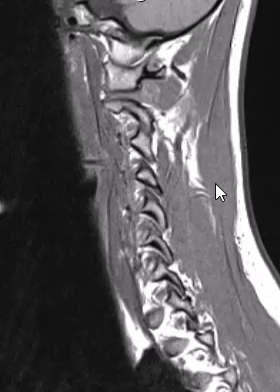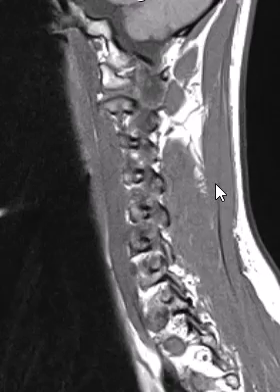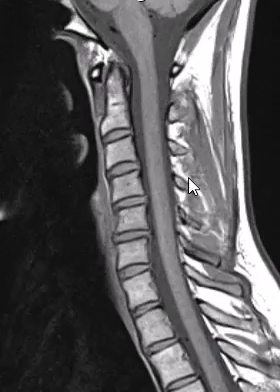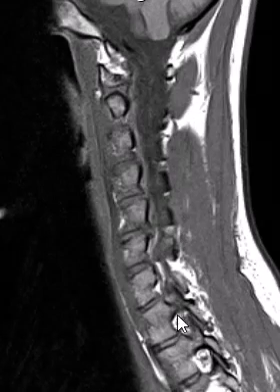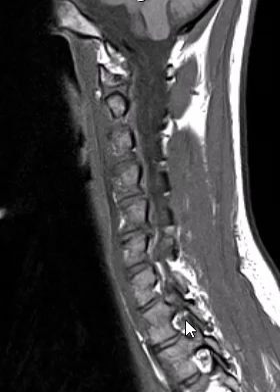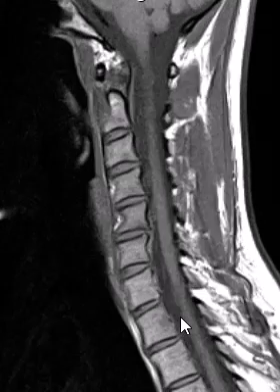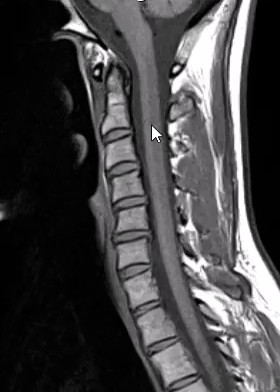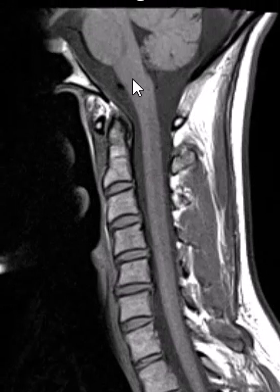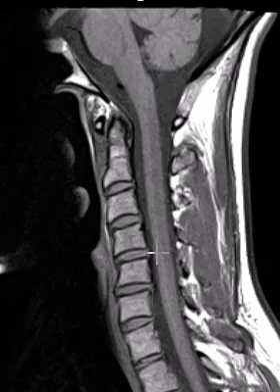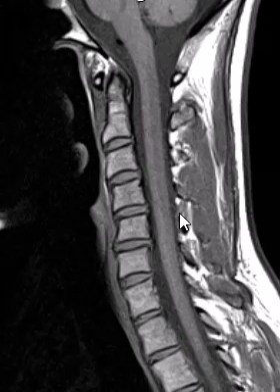We then roll off to the right and left sides to see openings called foramina, which are where the nerves exit. Looking at the left side down low, we can see the neural foramen with a little dot in the middle representing a nerve. On this sequence, fluid appears dark — we see fluid around the base of the brain and around the cord — but the next sequence will have bright fluid.